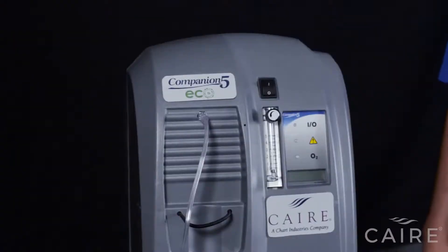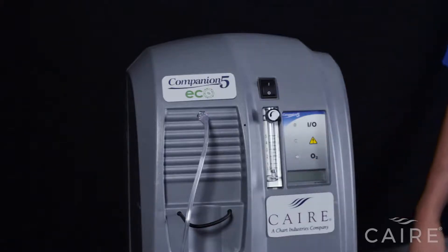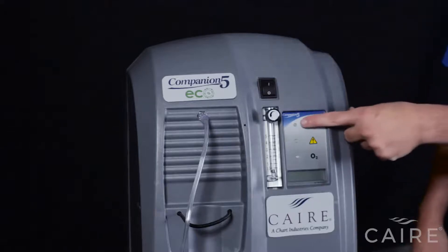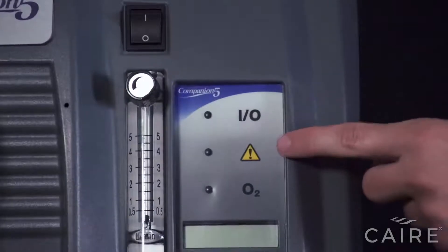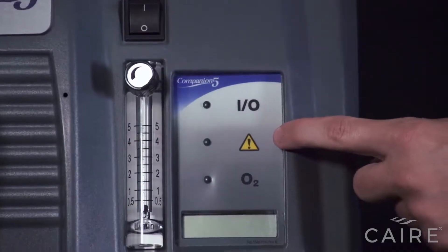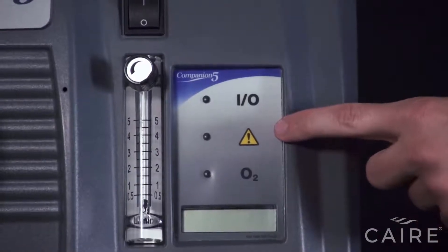Now that your cannula or tubing is connected, let's show you how to turn on the machine and use its controls. I'll show you the basic user interface, which is here — very simple and easy to understand. The top light is for normal operation and will show green when the unit is powered on and running properly. The second light is red, which is your warning light that will come on if there's an active alarm condition on the machine.